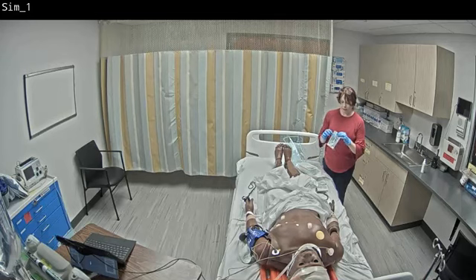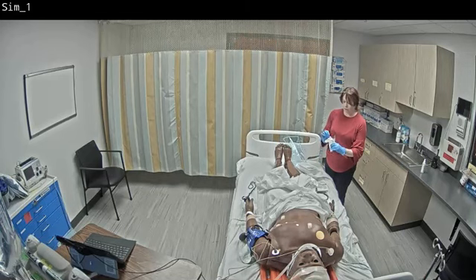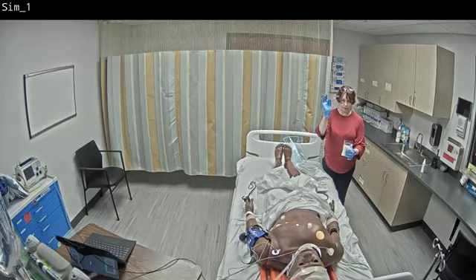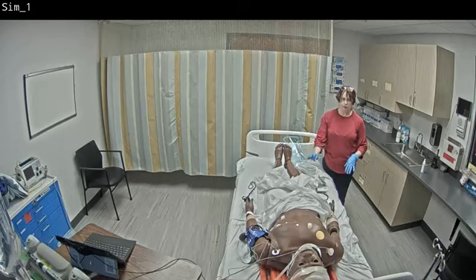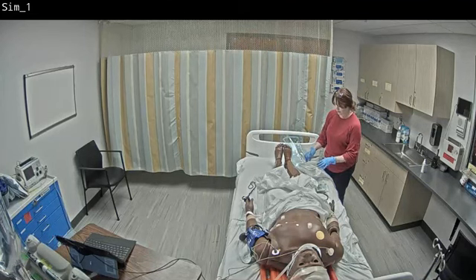The Betadine, you'll notice it doesn't look like it does in real life. You would open it up, and then you have your swabs. Like I said, they are dried, so you can actually touch the simulator with this, and you're not going to stain my simulator. They are dried, they are hard, so it is perfectly fine. Just touch the simulator and go through the steps that you would do to clean your simulator, I guess.